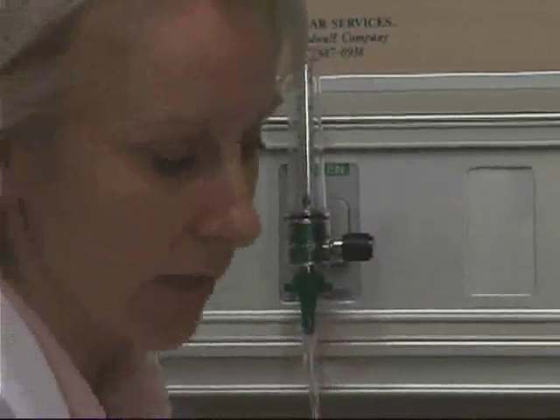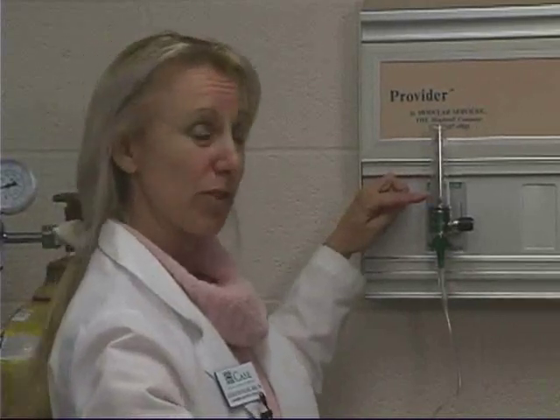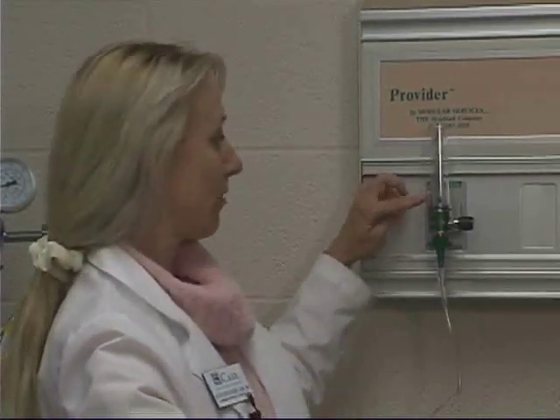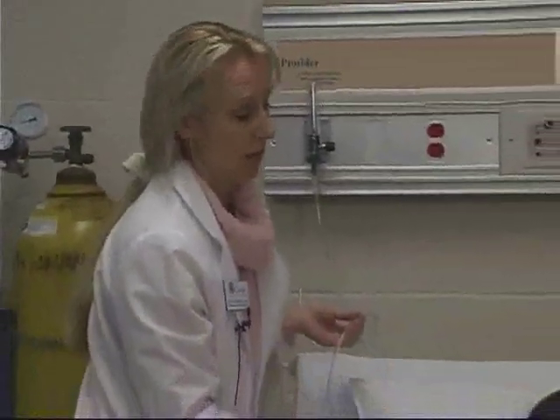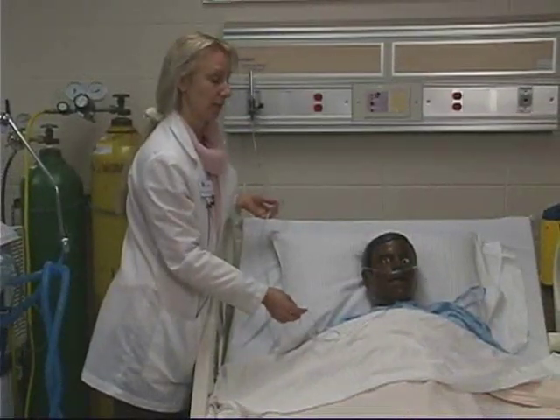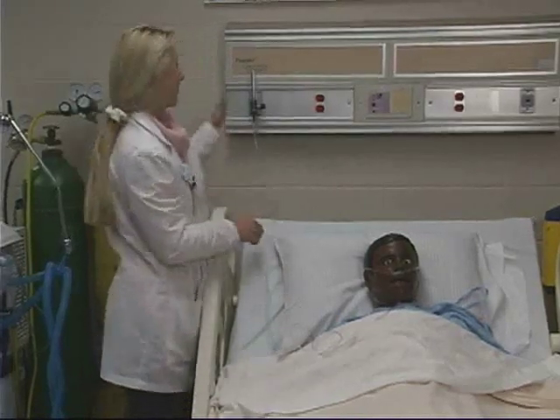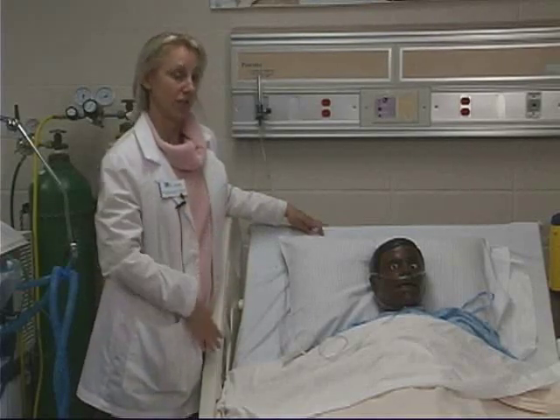Room air is approximately 21% oxygen. For every increment of 1 on this flow meter, you're adding approximately 3% of oxygen to room air. So for example, if you have this on 1 liter per minute, that will correspond to approximately 24 to 28% oxygen. That's not necessarily how much oxygen the patient is breathing, though — that's only one of three components. The other two are how fast the patient is breathing and how deep the patient is breathing. The rate of respirations, the depth of respirations, and the amount of oxygen you're delivering all three determine the range of inspired oxygen the patient is actually getting.